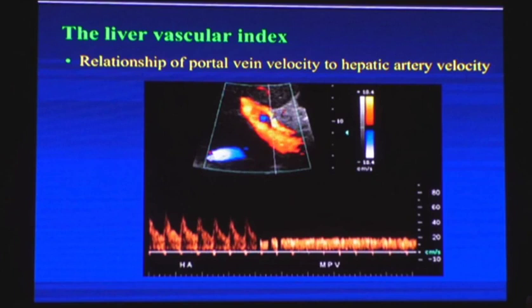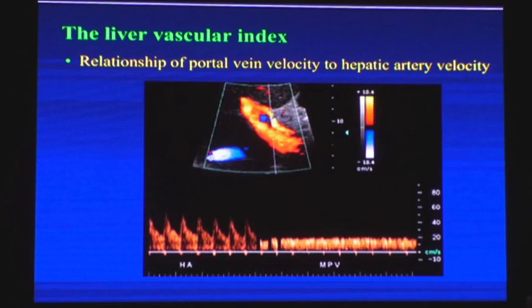Another important point is the vascular index: normally, the diastolic velocity of the hepatic artery and the portal vein velocity should be at par — very near to each other. You can open the sample volume to take both hepatic artery and portal vein waveforms simultaneously. Both are nearly at the same level initially. But with the passage of time, hepatic artery flow increases and portal vein flow decreases as the liver becomes stiff and fibrotic.